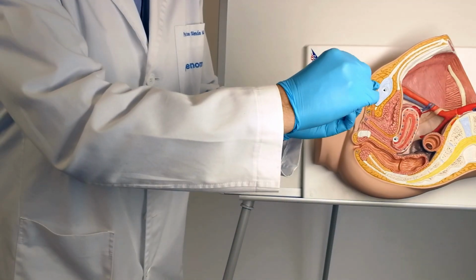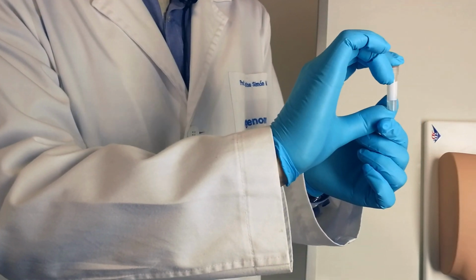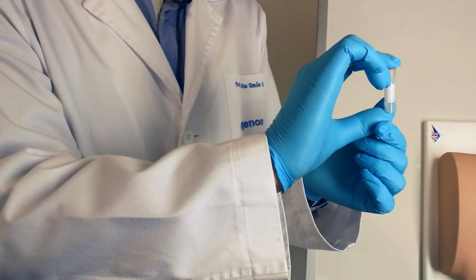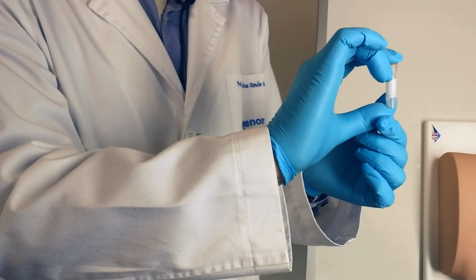Shake vigorously a few times to ensure that the sample is completely mixed with the preserving solution within the tube. Label the cryotube with the patient data and keep it in the refrigerator, not the freezer, for a minimum of 4 hours. Now the sample is ready to be shipped.